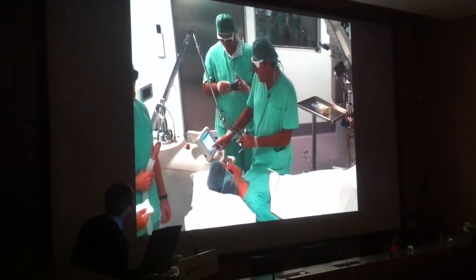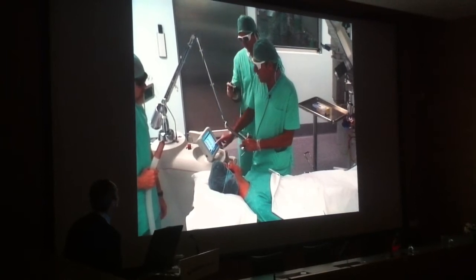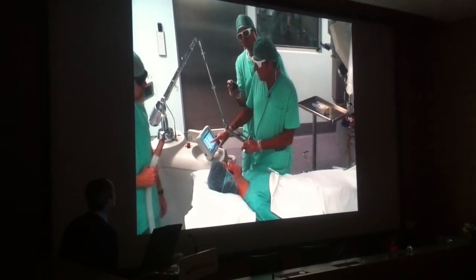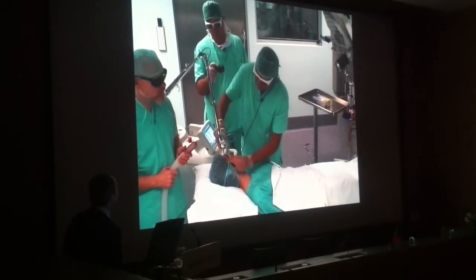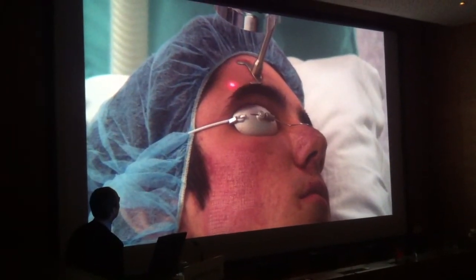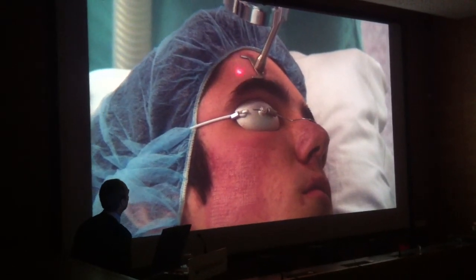So for the feathering, I just go back with a much more shallow ablation depth, lower coagulation, and I increase the density. Okay? So basically I've doubled the density, but I've diminished the others. And this is a very good treatment for the forehead. As you see, I don't have to go to standby. I can just change my parameters while working without wasting any more time.